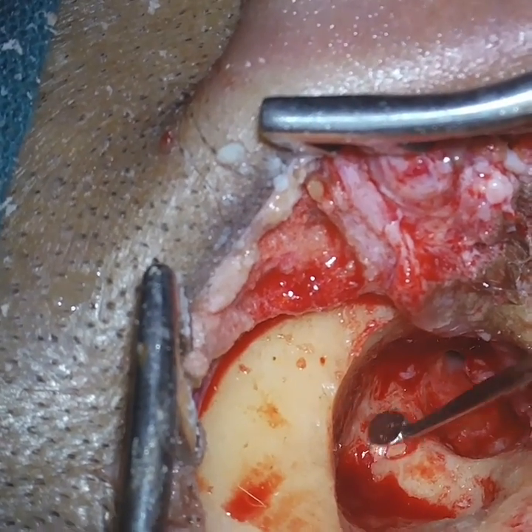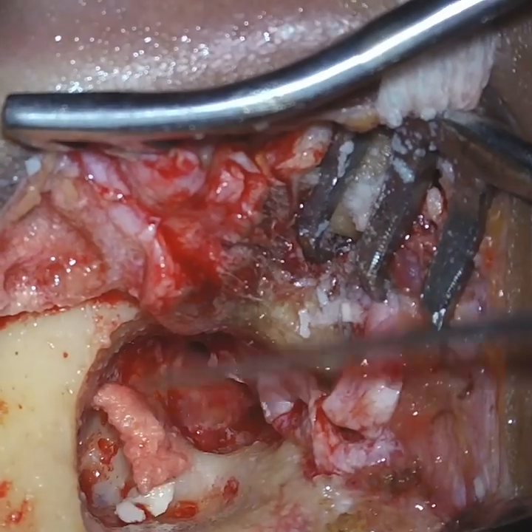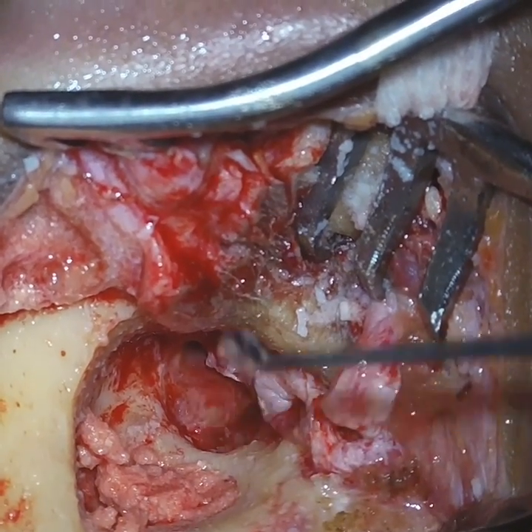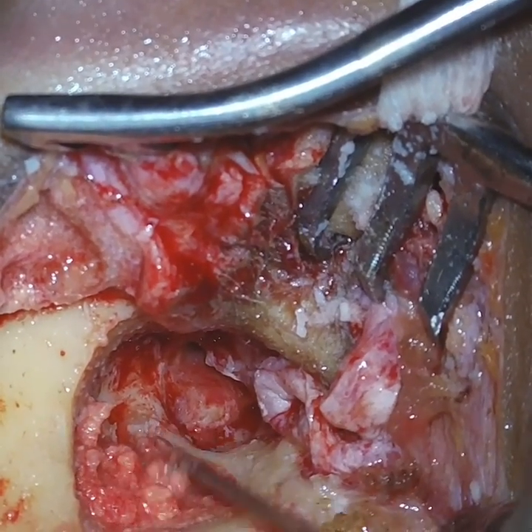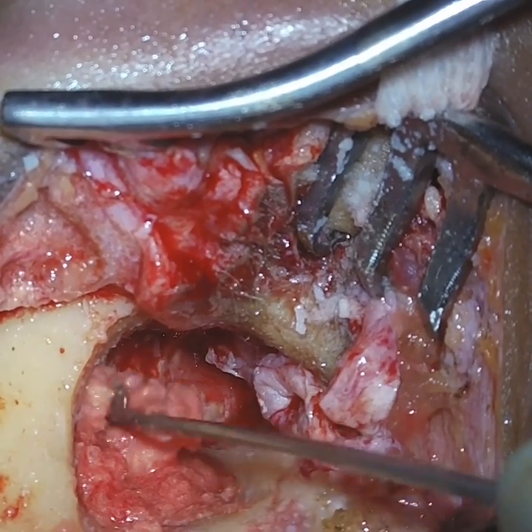So after the plugging with cartilage, now we started to obliterate the cavity. Here we are just obliterating the cavity, like you see. It's a bone paté with antibiotic ear drops, and along with that we have some cartilage pieces which we have harvested from the concha, and then we close the area with the concha.